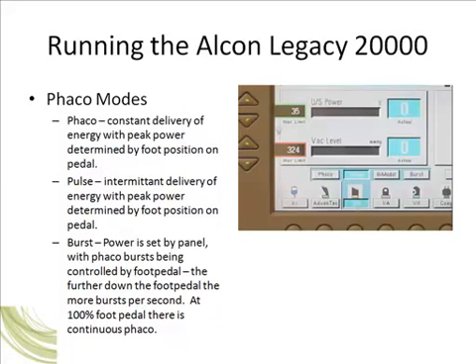In burst mode, we have another way of giving phaco energy, by cycling the phaco energy essentially. However, instead of having linear control of the phaco energy in foot position 3, you have linear control essentially of the time between the phaco pulses.